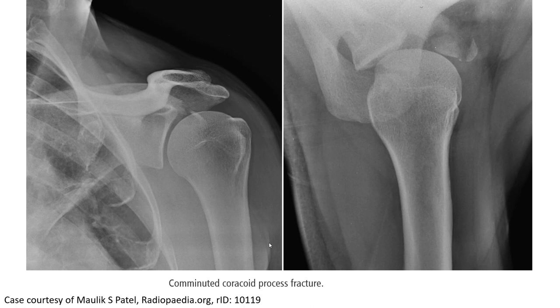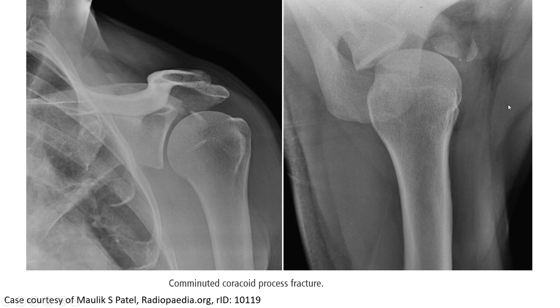This is an example of a coracoid process fracture. We are unable to identify clearly the fracture on the frontal view, but we can still see the fragmentation and lucent fracture line. However, it is seen clearly on the axial or lateral shoulder view across the coracoid.